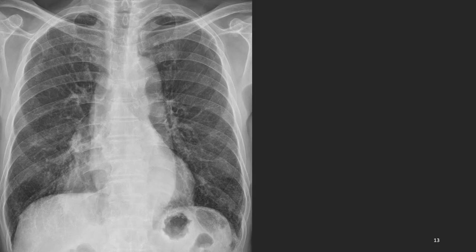What do we see? And where is the mass? We already know where it is. Yes, it's the right lower lobe, a large mass. Why do we know? Silhouette sign, yes. The right heart border is preserved. Diaphragm is okay. So this means a right lower lobe medial side mass.